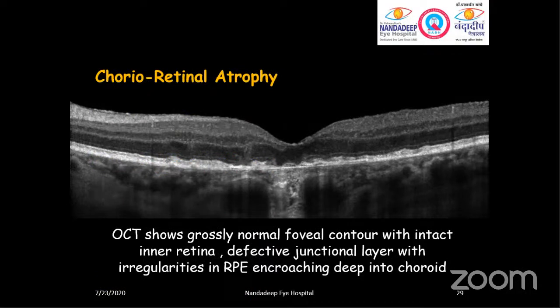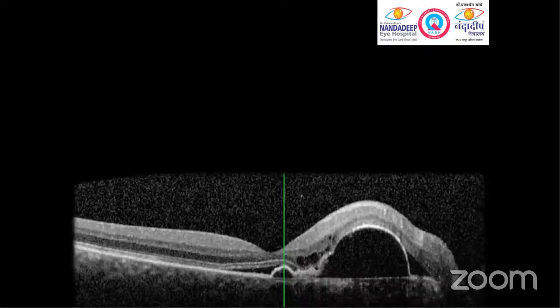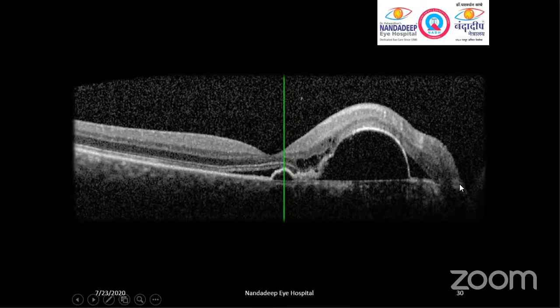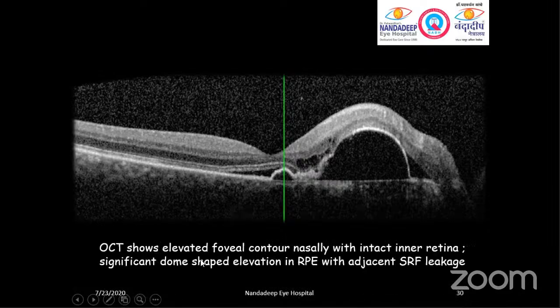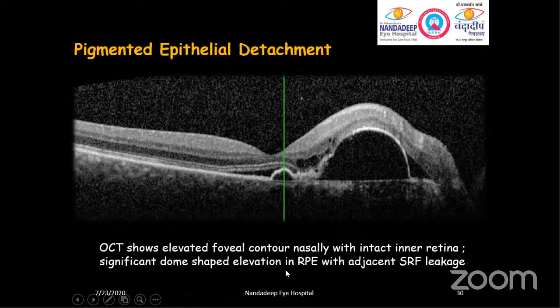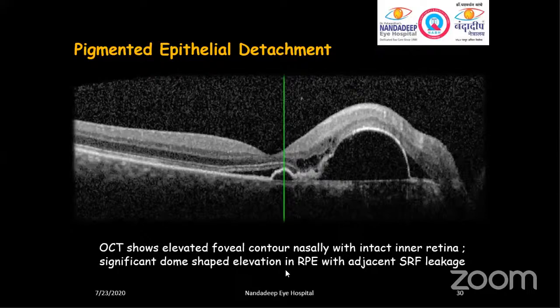This is a typical case where part of the foveal contour is normal but another portion is abnormal — somewhat elevated toward the nasal side, as indicated by the slope going down. This indicates the right and nasal sides of the scan. The nasal part of the foveal contour is elevated, and there is a dome-shaped elevation at the outer retina portion with adjacent subretinal fluid leakage and few cystic changes. OCT shows elevated foveal contour majorly on one side with intact retina, significant dome-shaped elevation of RPE with adjacent SRF leakage. In cases of pigmented epithelial detachment (PED), you may experience this kind of image. There are different forms of PED — serous PED, hemorrhagic PED. This is one classical PED image.